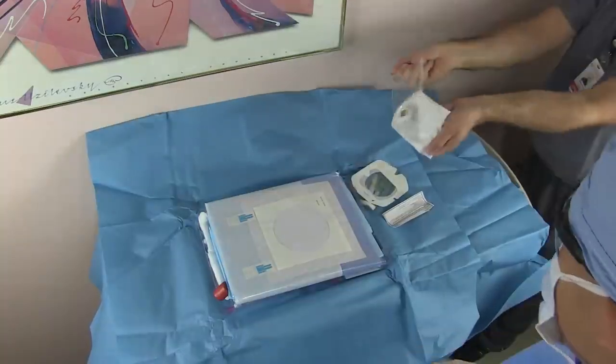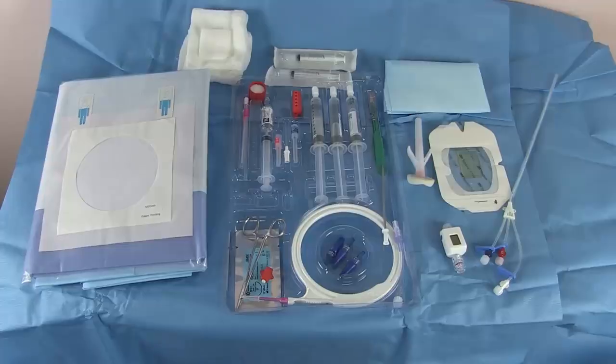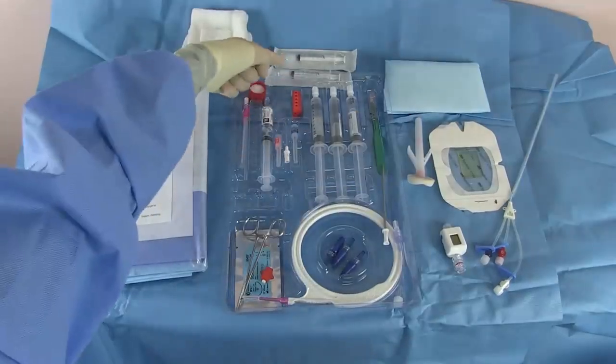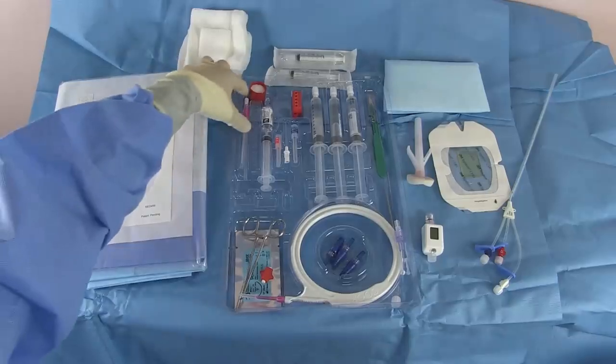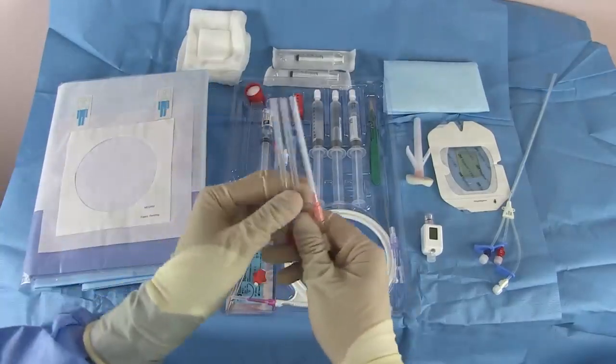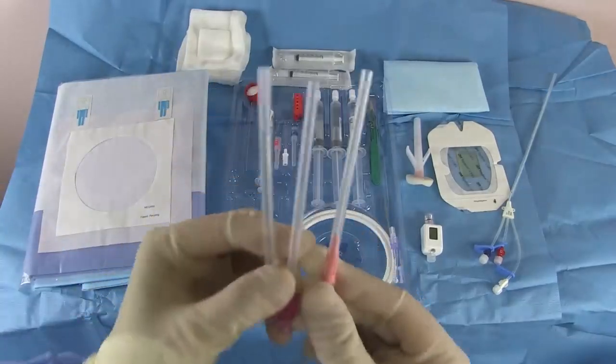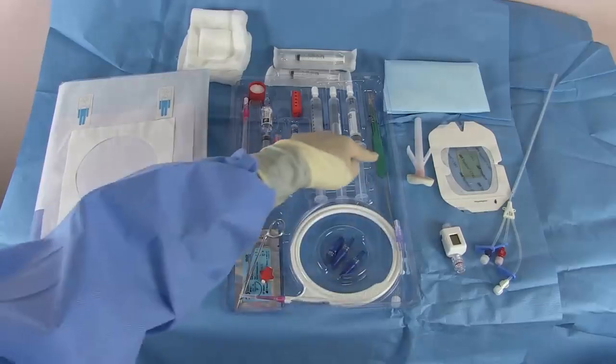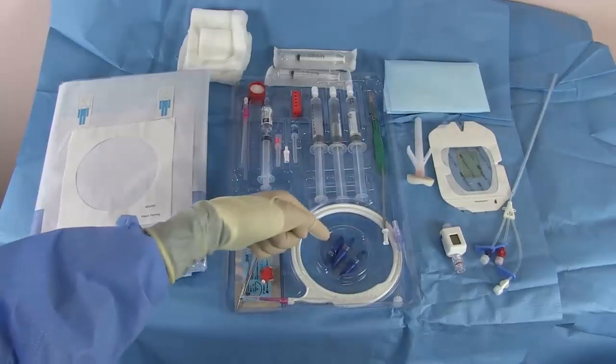There's the drape, the prep stick, the lidocaine syringes and needles we need to inject. Here are a few finder needles. One is long, one is short, and one has a small catheter attached to it. Here's the guide wire in its sheath. Here's the dilator for the skin. Knife. Sterile saline flushes. Caps for the catheter.